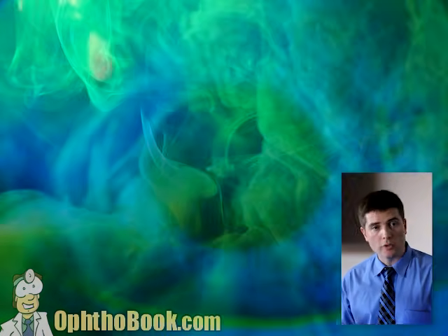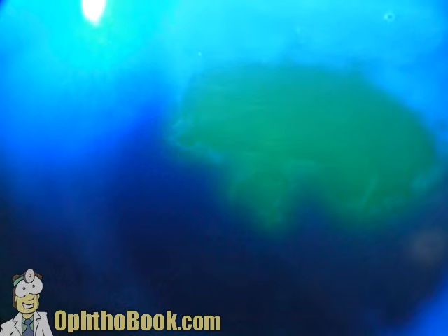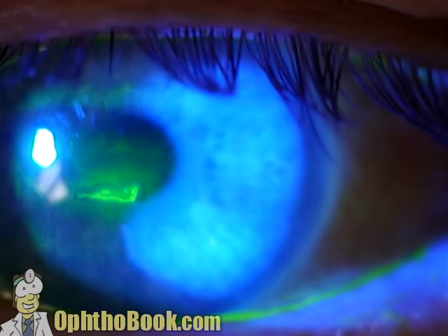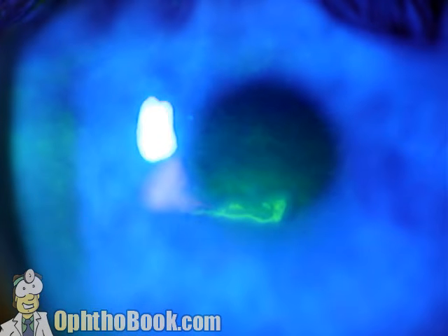but of course we use it in the eye for looking at things like a corneal abrasion, which may be hard to see with the naked eye, even using a microscope, but raw areas will uptake this yellow material and it'll glow under a blue light. I'll give you a better example here. Scratch on the surface of the eye, and that fluorescein sticks to that area and is very easy to see with the blue filter. It's also useful for finding leaks.